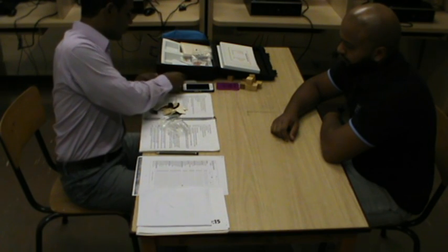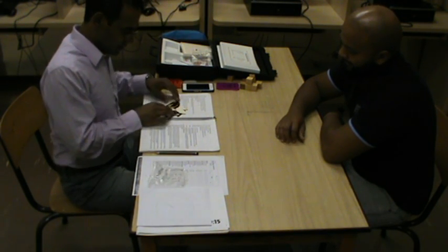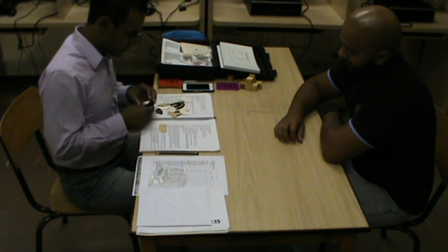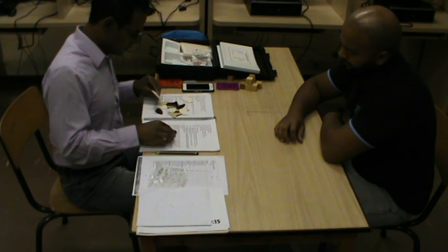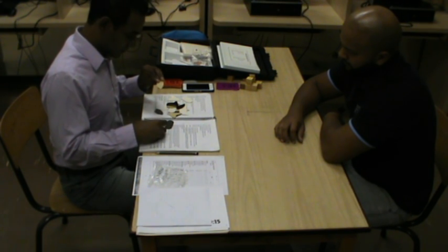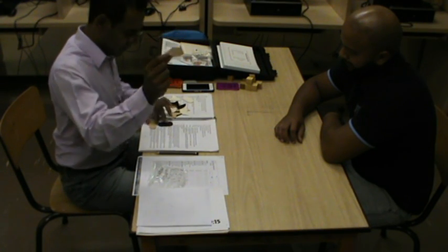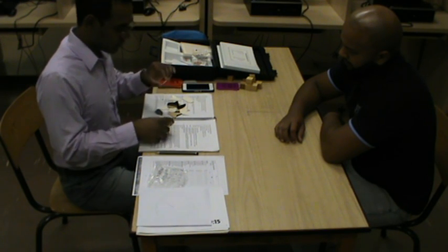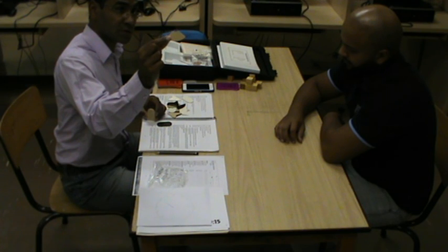The next section is called HISCA, Object Classification. So here there are different types of shapes. It's an arrow shape, looks like this. There's an oval shape, which looks like this, I think, yes. And then there's a quarter donut, which I think, oh, it's the other way around. This is the oval shape, and this one is the quarter donut.